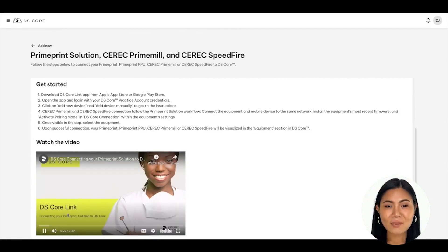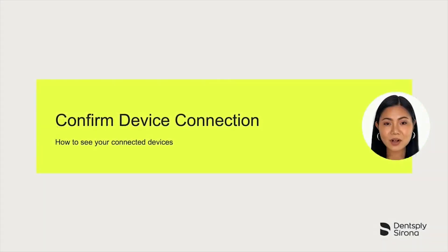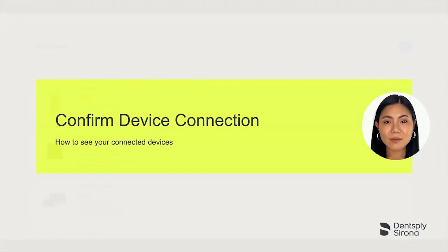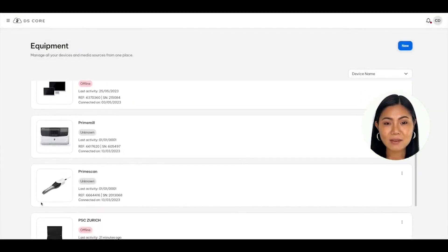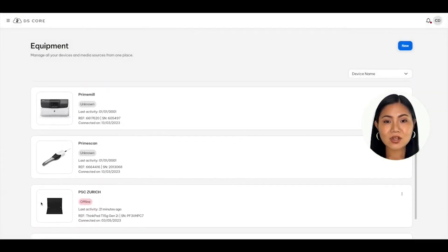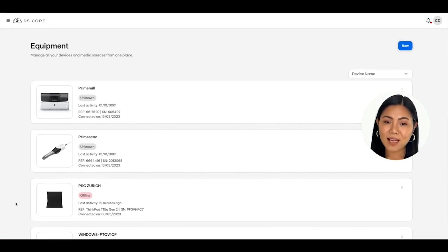Follow these 6 steps and watch the support video if you need additional support. Once you have completed connecting your devices, return to the equipment list to see and confirm your devices were connected. Please note that the devices shown in this video are currently offline — your equipment will show as online or active.